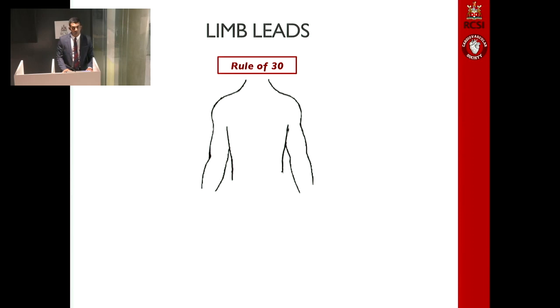It's very simple. We draw a simple T shape and label each line sequentially. Starting on the left, the first line is lead 1. The second line pointing down towards the patient's feet is AVF, F for feet, and the third line is imaginary. We then pencil in all the other leads in 30-degree intervals to the lines we've already drawn.